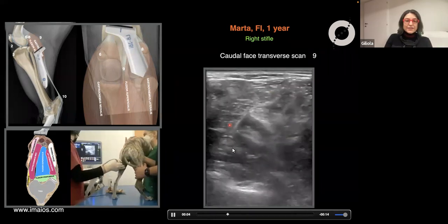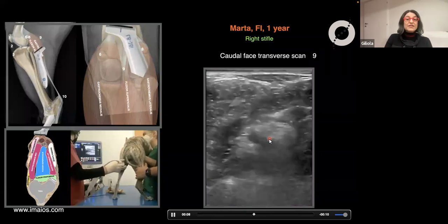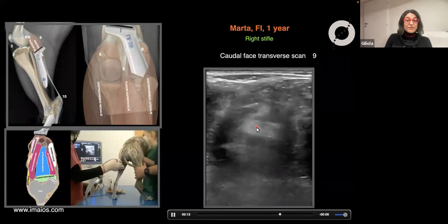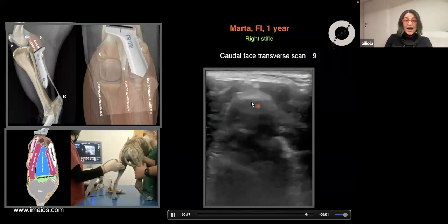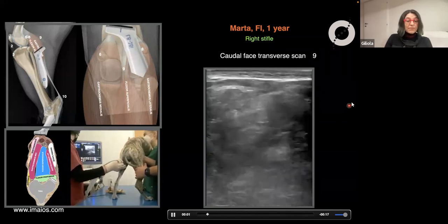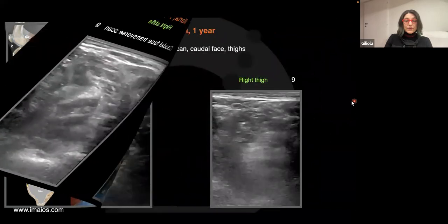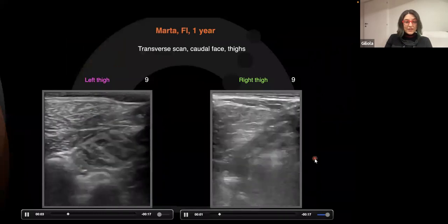This part here is the flexor superficialis. I know that this dog has a severe inflammation in the flexor superficialis, so severe that it stays so for 6 months, and the dog is still lame after trauma. And it's quite impressive to see the difference.